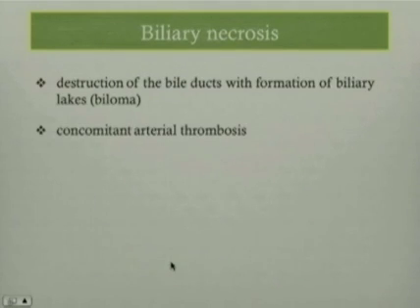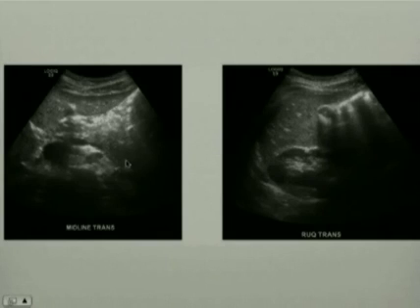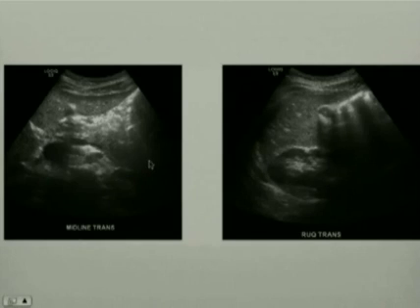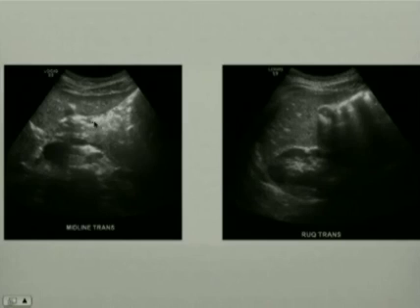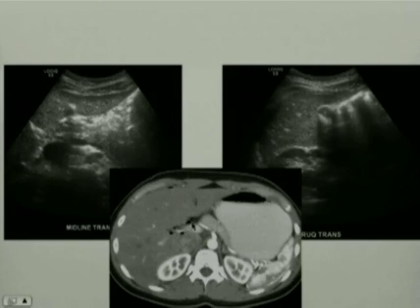Just some rare causes — non-biliary and non-hepatic causes of right upper quadrant pain include perforated duodenal ulcers and some renal causes. Looking at two ultrasound images of the right upper quadrant demonstrating the liver, you would notice there is an extra amount of air more than you would normally see in a patient. When the patient underwent CT, this suspicion was confirmed — there were extra-luminal foci of air in the right upper quadrant, and the patient was taken to surgery and confirmed to have a perforated duodenal ulcer.